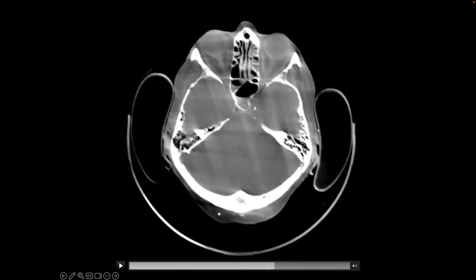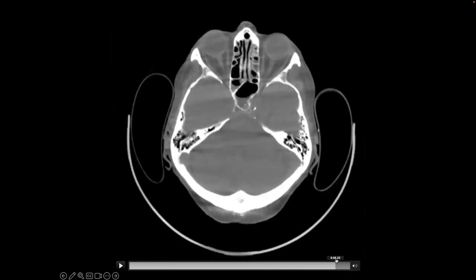Okay. You can see down here, there's still sort of a dark zone there that fills in with the last few projections. And now you get really nice details.